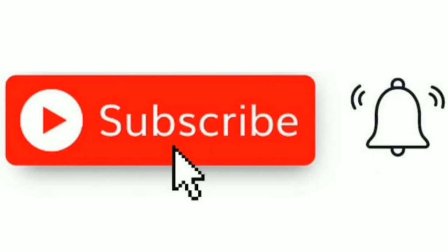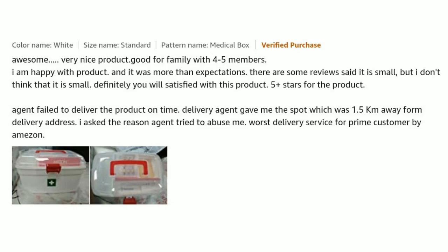Let's start the video. Awesome, very nice product — good for a family with four or five members. I'm happy with the product and it was more than my expectation. Some reviews said it's small, but I don't think it is small. Definitely you will be satisfied with the product. Five stars.